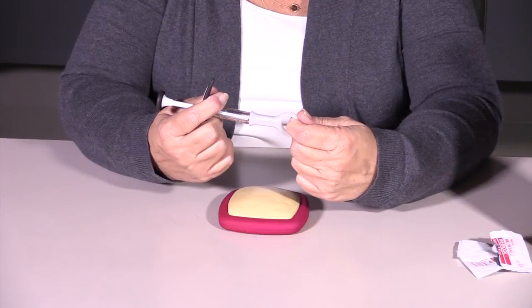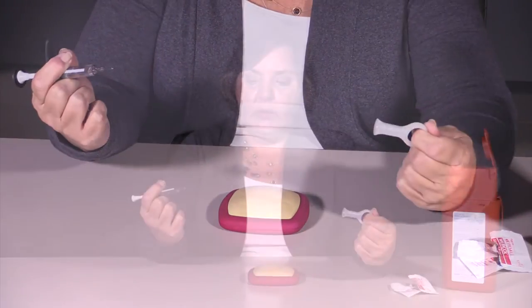To do your injection, all you're going to do is pull the cap from the syringe. It's a very short needle — you'll see it really isn't big enough to go down into muscle.